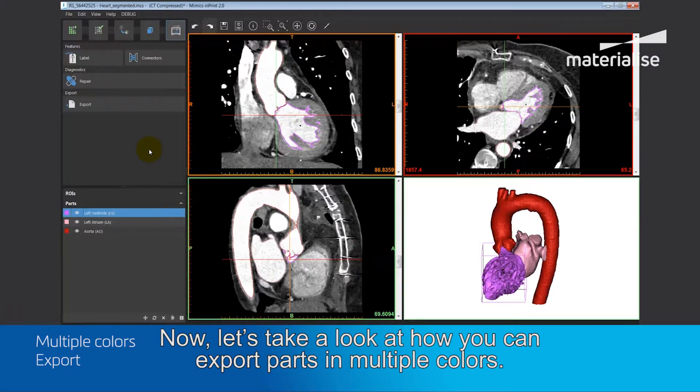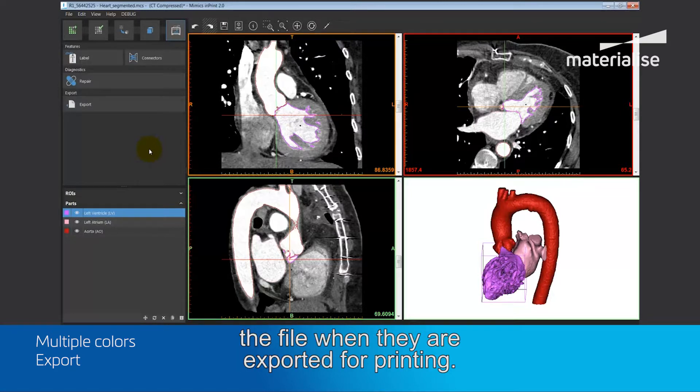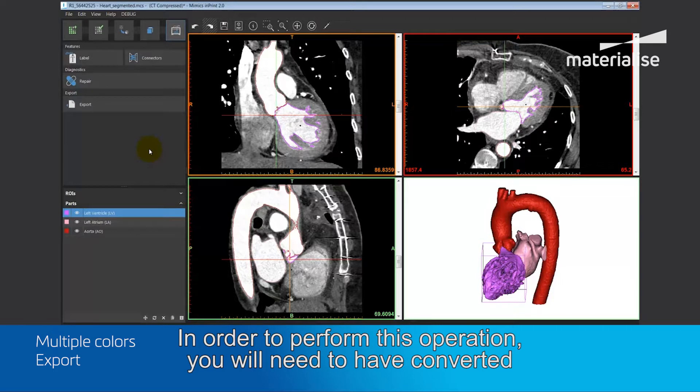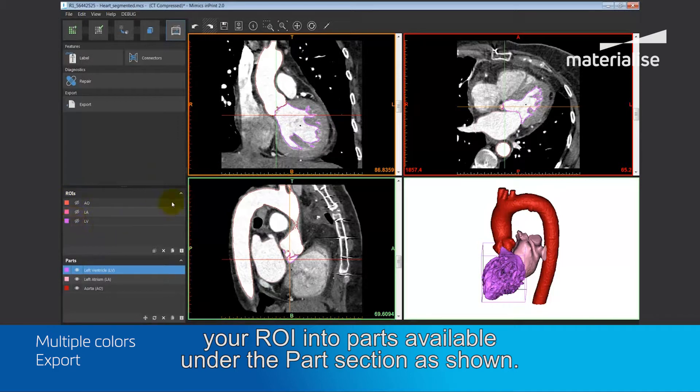Now, let's take a look at how you can export parts in multiple colors. Multi-color means that the parts will retain color information inside the file when they are exported for printing. Again, in order to perform this operation, you will need to have converted your ROI, regions of interest, into parts available under the parts section as shown.